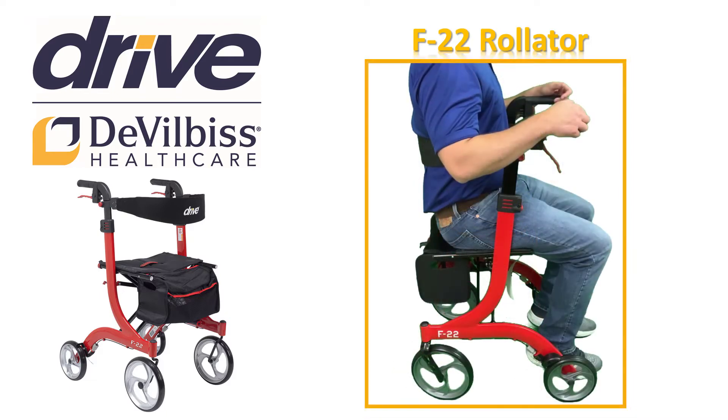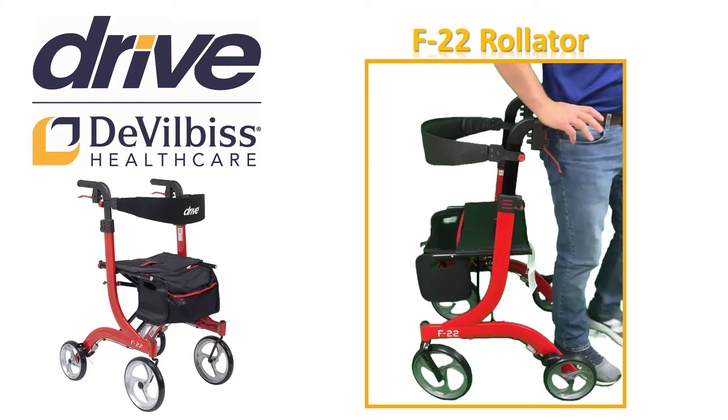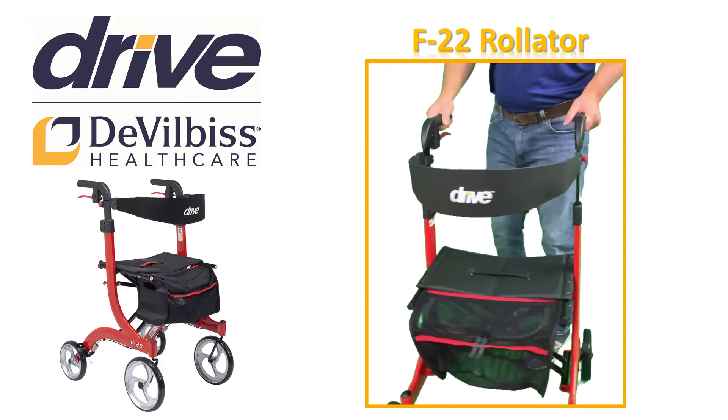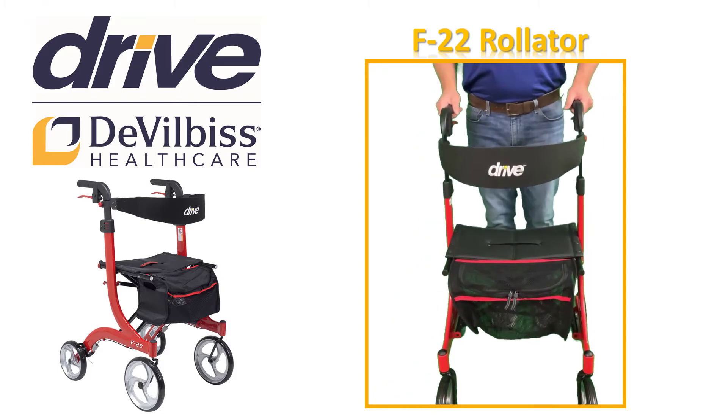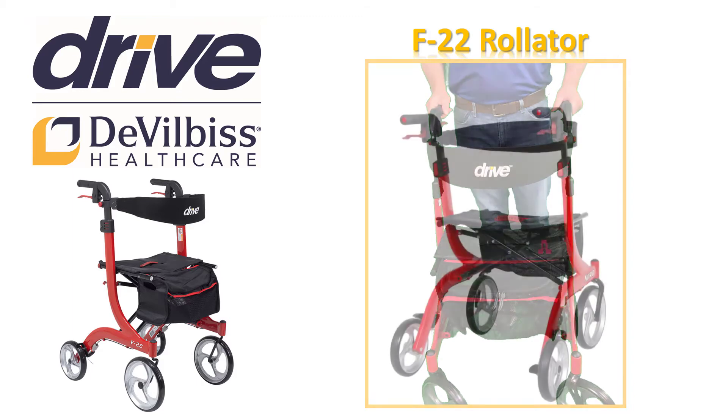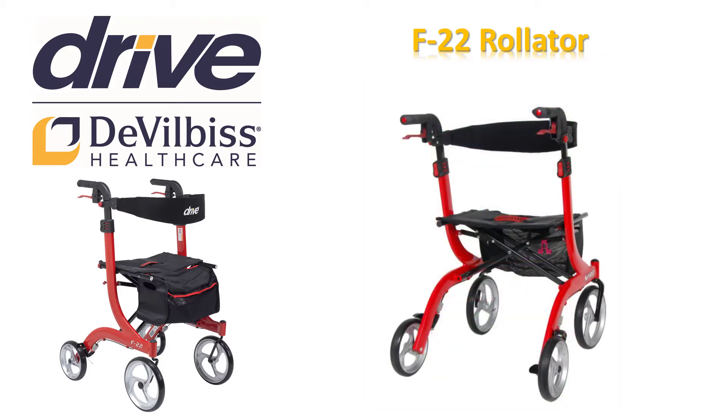When you are ready to stand, put your hands on the hand grips and use them to assist you as you stand up. Your new F22 Rollator is now fitted to your individual needs and will be safe and comfortable for many years of use. The F22 Rollator has a feature to help you safely go over different surface heights like curbs or door thresholds. It is important to use the curb hopper feature for your safety and to protect your wheels.